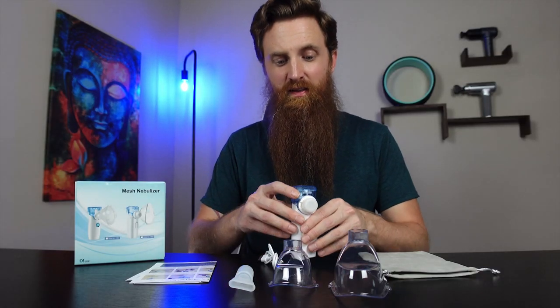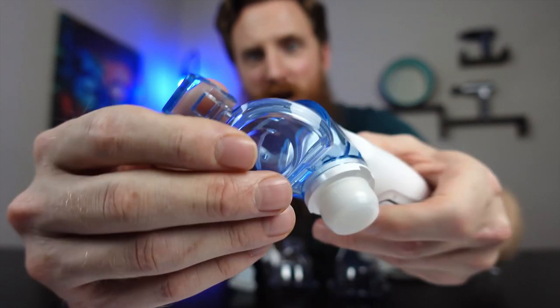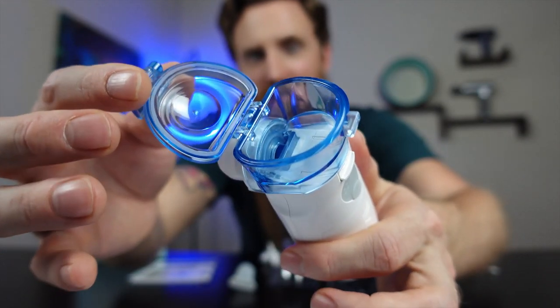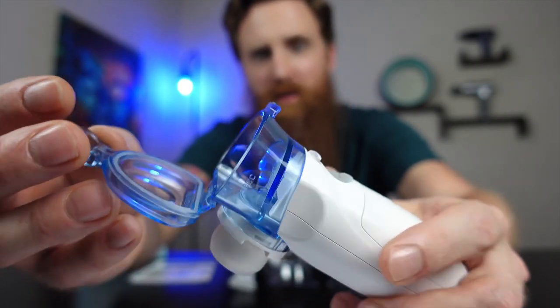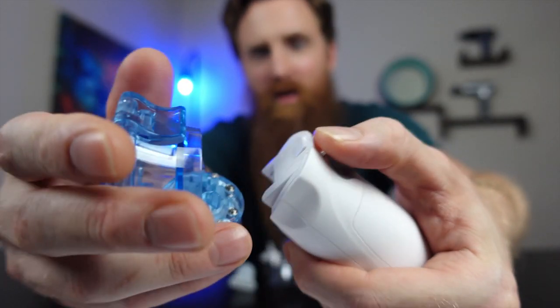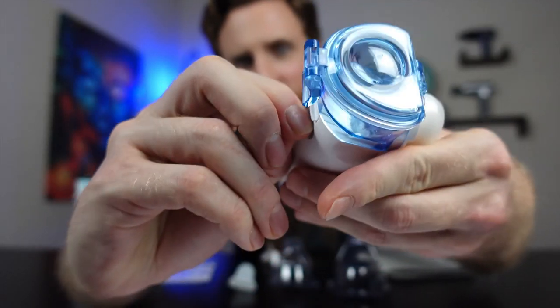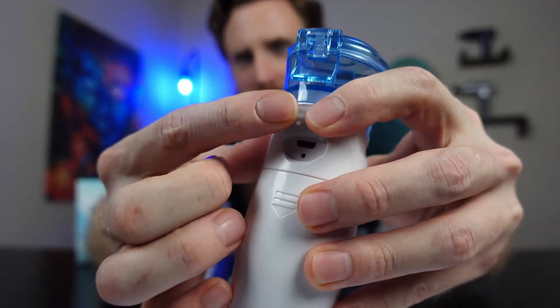Here's everything that comes with it. Here is the nebulizer — you put the solution in the top right here. It doesn't come with the medical solution, so we won't actually be testing it today. This part also pops off, and you can take that off as well.